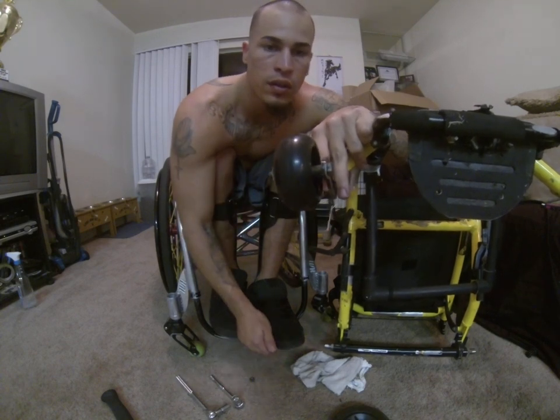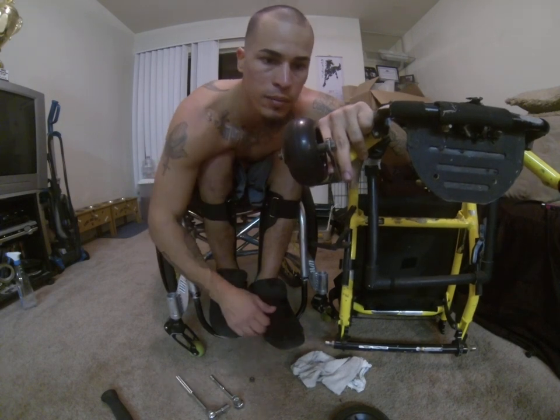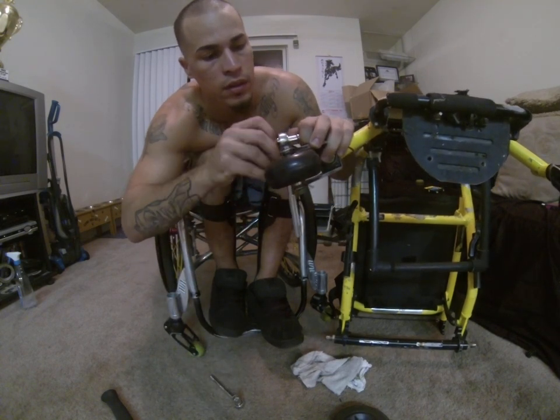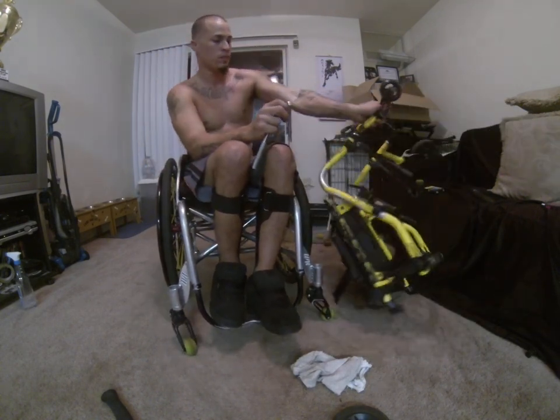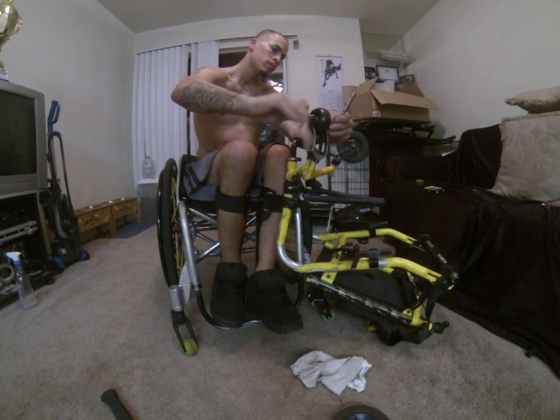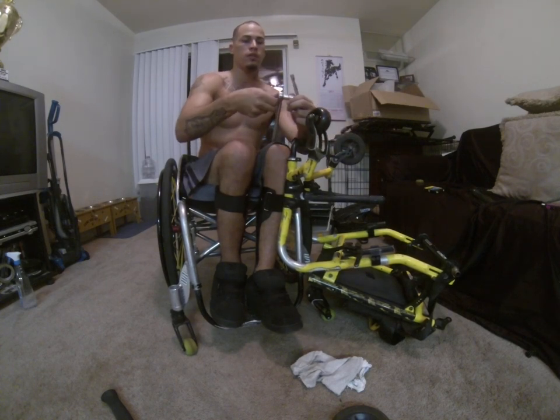So there it is. This is not spinning too good because the bearings are old. They're not that amazing. Usually mine spin really good, but this will do. So then that's it. You just put the bolt back on, and it's good to go. You don't want to put it too tight, because then it'll pinch on the bearings and it won't let it spin. But tight enough that the nut is not going to fall off the bolt.